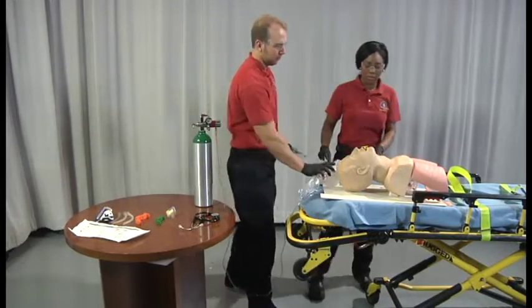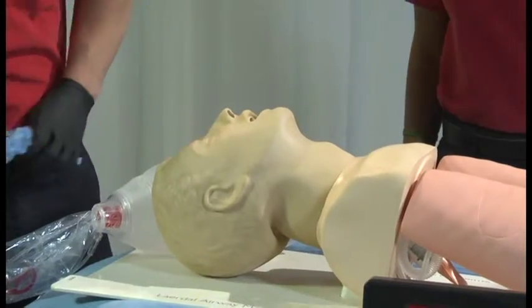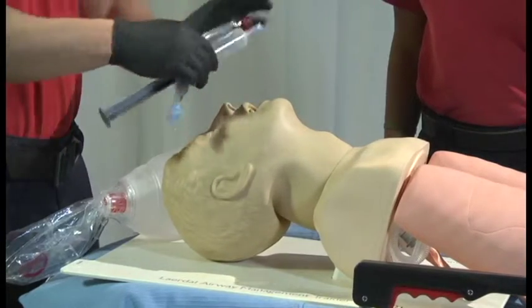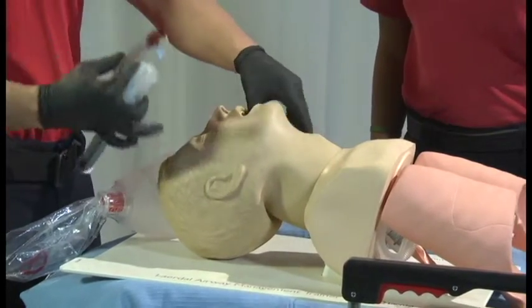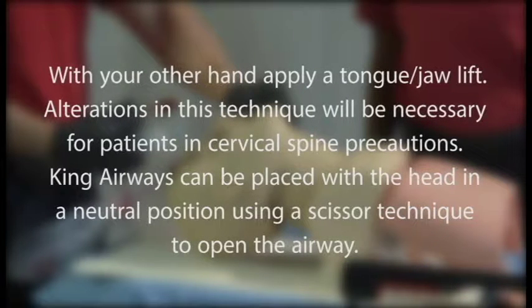After pre-oxygenation, have your partner step out of the way. Remove the simple adjunct and place the patient in a sniffing position. Hold the airway device in your dominant hand. With your other hand, apply a tongue-jaw lift. Alterations in this technique will be necessary for patients with cervical spine precautions.